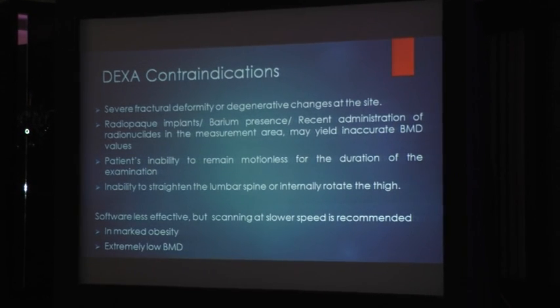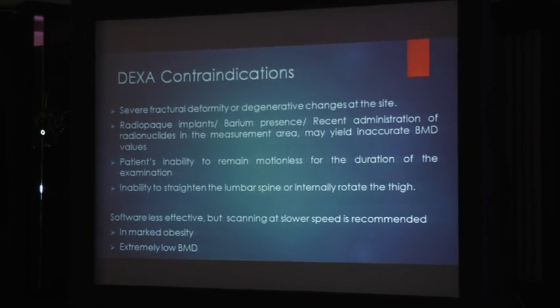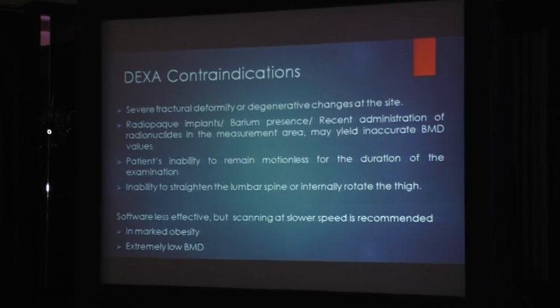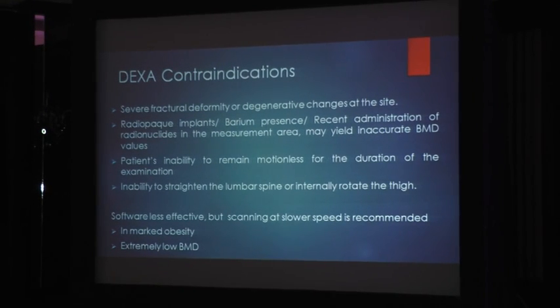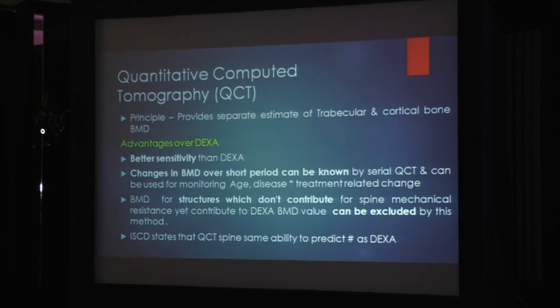If the patient cannot remain motionless during the scan, cannot straighten, or cannot rotate the thigh, then we cannot use it. The software doesn't work very well in markedly obese patients and extremely low BMD patients, but it can be used by slowing down the scan speed.